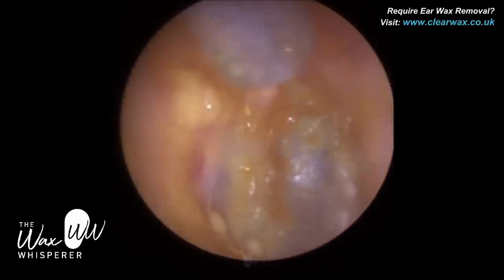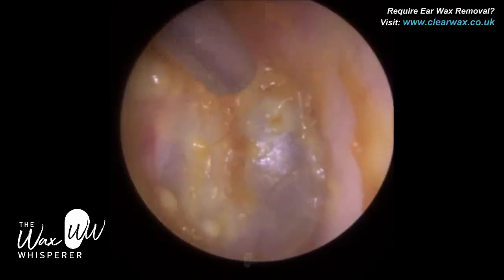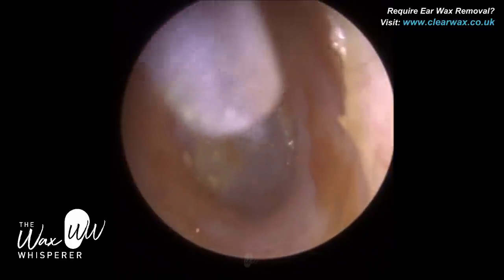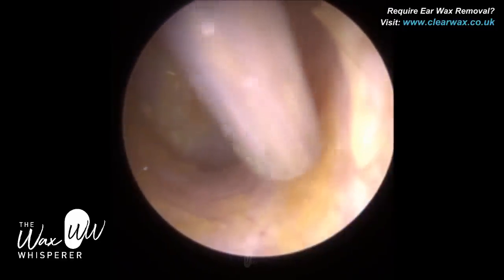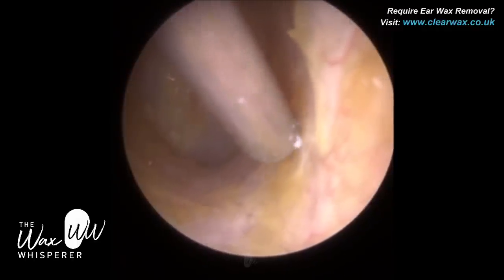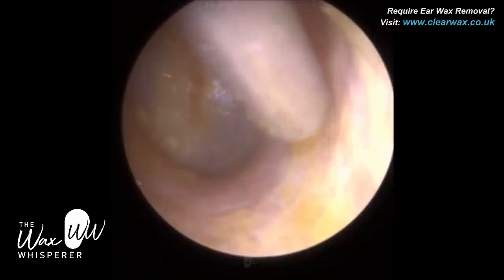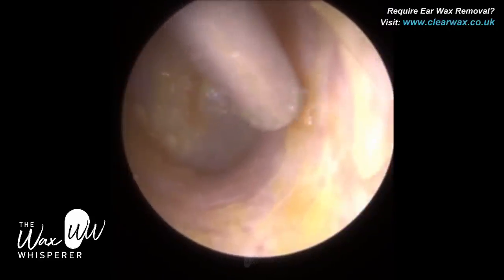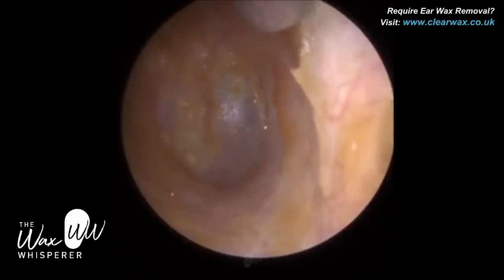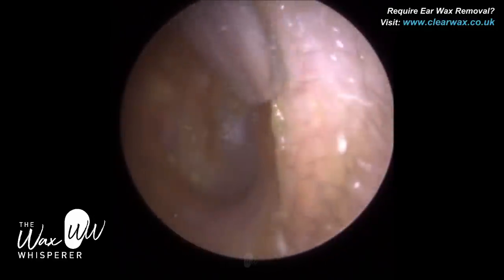I'm quite happy with that. You can see the whole eardrum — if you remember what it looked like before, look at what it looks like now. The eardrum has a blue tinge — that's what we expect. You can see the hammerbone centrally. There's just a bit of soft coating wax laterally on the cartilaginous portion. As I mentioned, the outer third of the ear canal is made up of cartilage, so it's semi-flexible with some muscle and fatty tissue. The skin lining the outer third is also a lot thicker — about one millimetre in thickness.